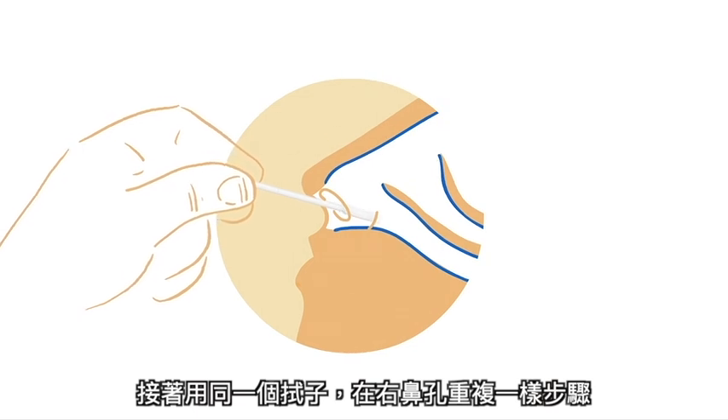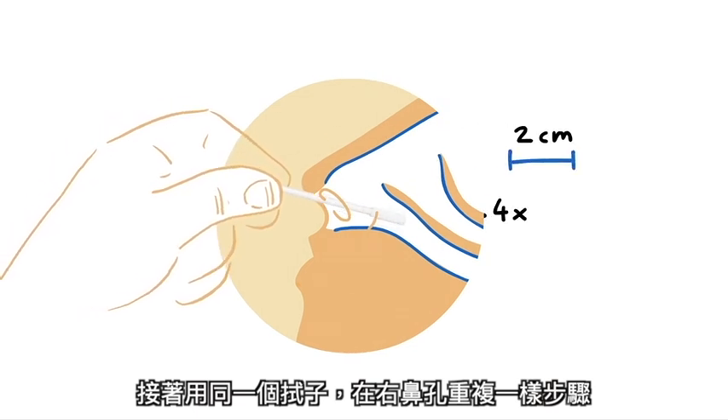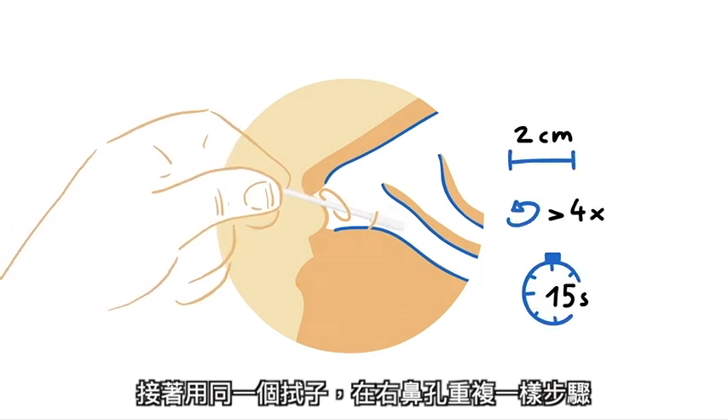Repeat the process in the other nostril using the same swab. The sample must be collected from both nostrils using the same swab.